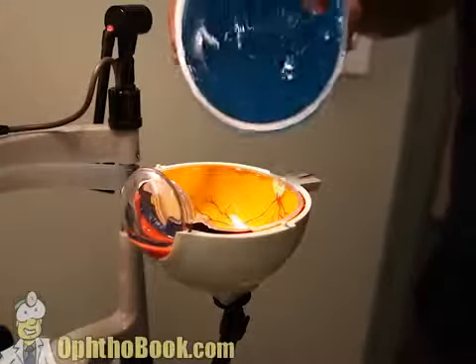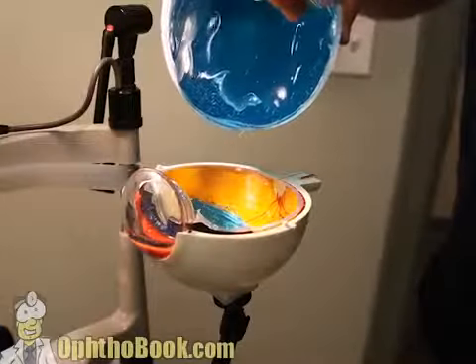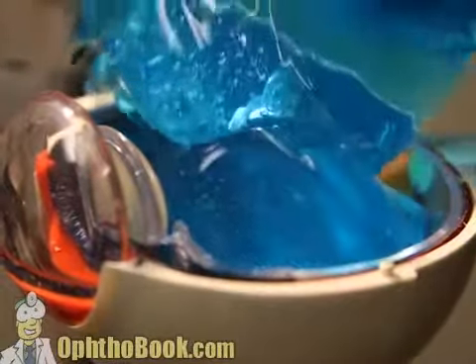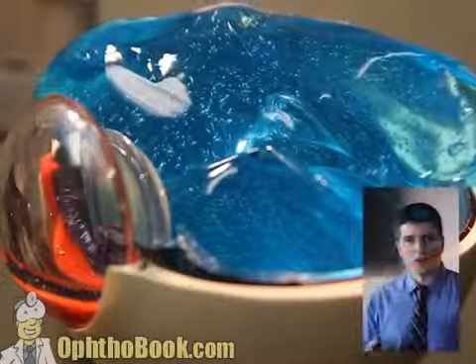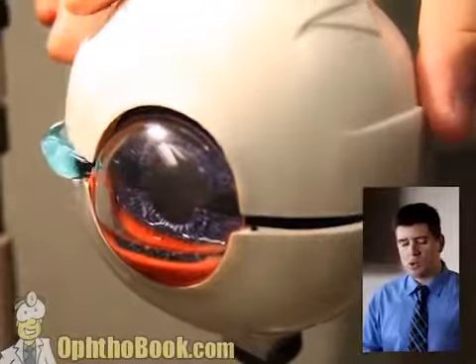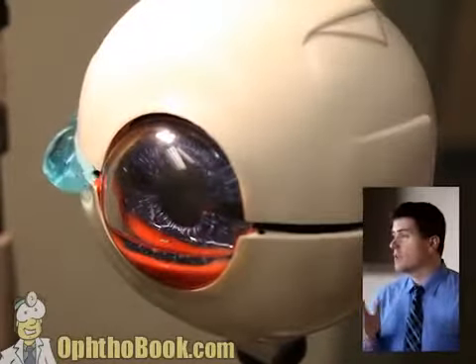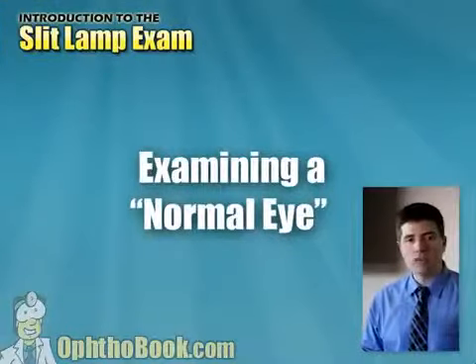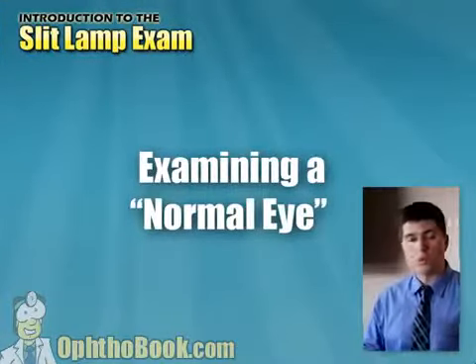As we know, the vitreous is filled with a clear fluid, very much like Jell-O or Jell-O dessert. But unless there's red blood cells, some type of retinal detachment, for the most part it looks like a dark space, at least with the anterior eye exam. And if we close it, you can see it's quite dark inside there. Okay, so the 8 structures, el ocho, we learned it on the eye model. Let's move on to a normal eye, and we'll repeat ourselves and see what normal looks like.